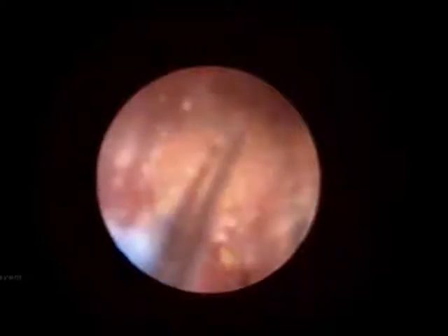Stone fragmentation continues. This is the laser fiber inside the stone, held within the dormia. The stone is getting smaller and smaller inside the dormia and eventually it will escape from the dormia. You can still see the fragments as we continue fragmenting.